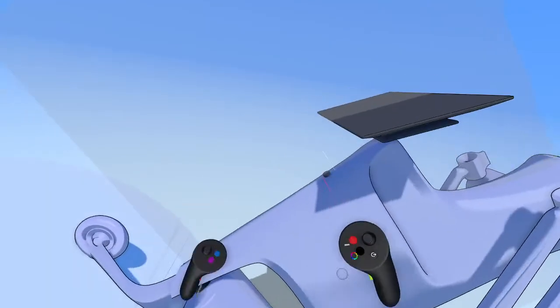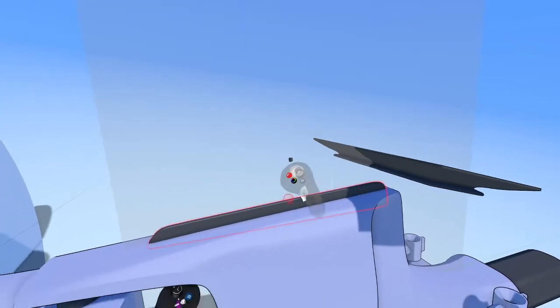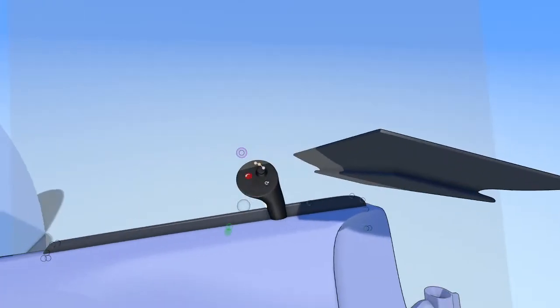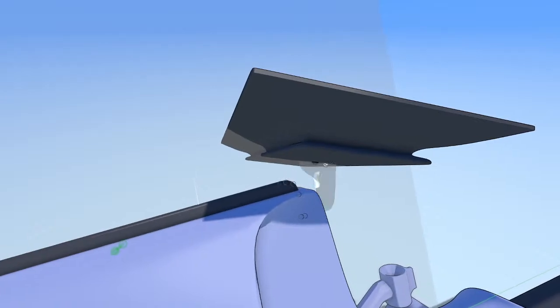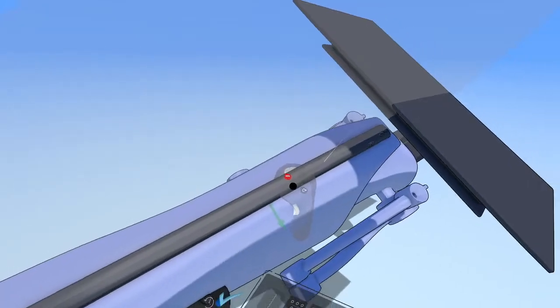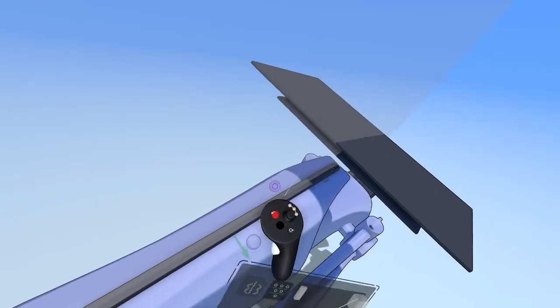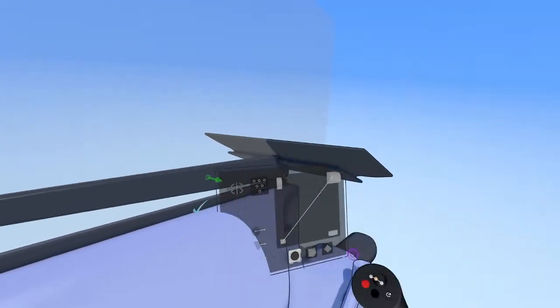rail here for it. So we're going to use the planar tool, or the volume tool, with the planar option turned on here. And that allows you to make these really quick volumes. Snapped to a plane. And then you can use this arrow here and select how far you want that to be extruded out. And what we're going to do is duplicate that and add some more detail here.